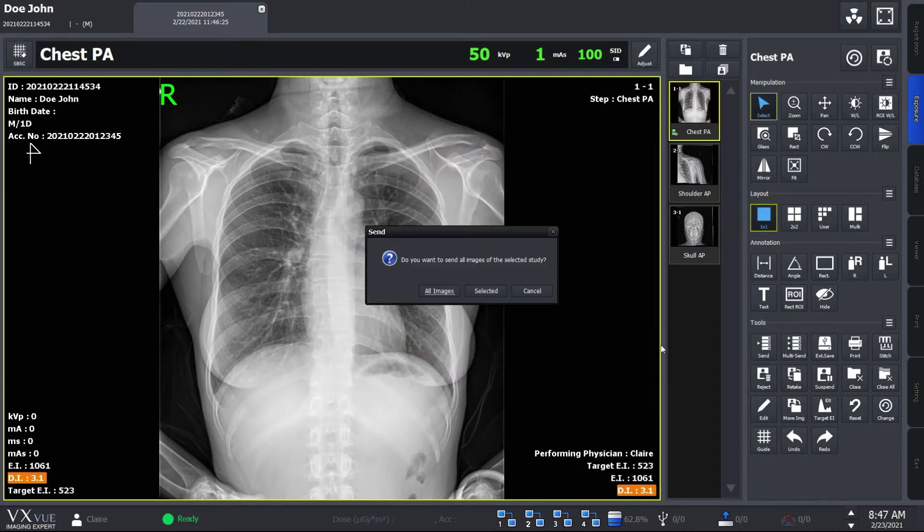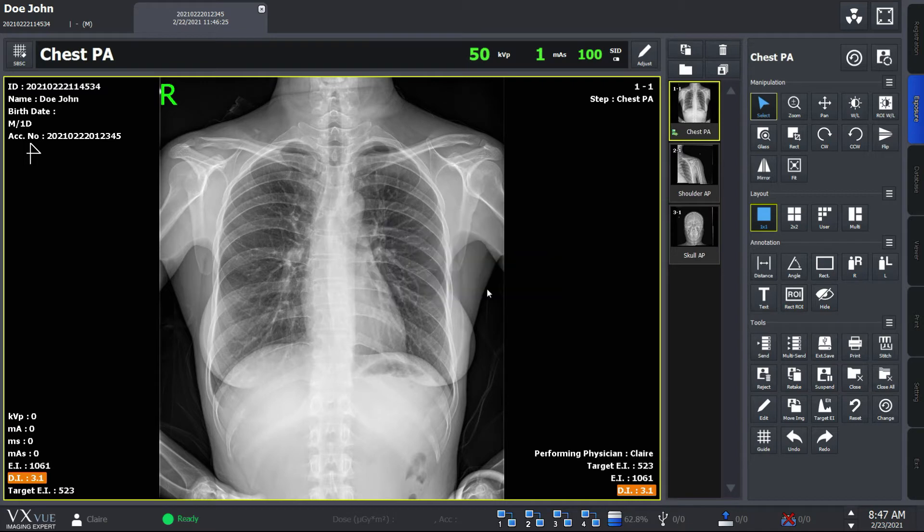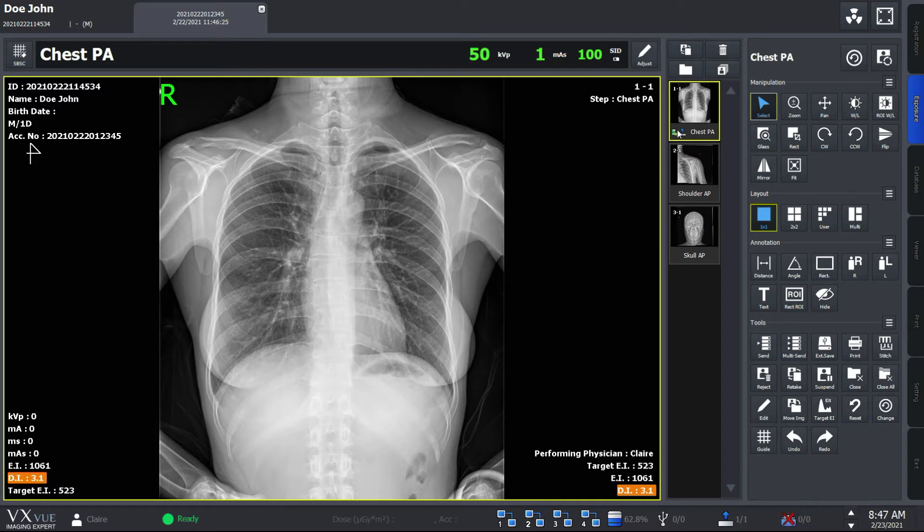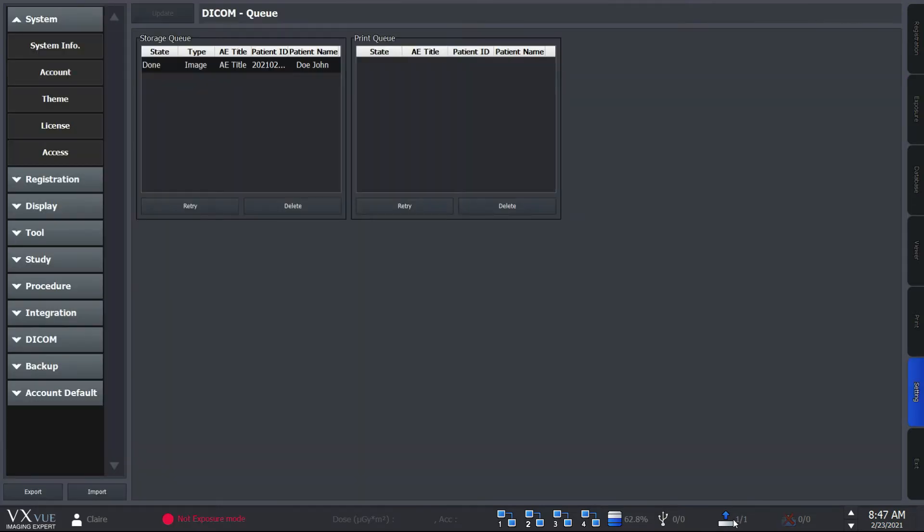The send function allows you to send images to PACS. After sending the images, you would want to check the sending status, and you can do this by checking the thumbnail or checking the status bar down here. Clicking this icon brings you to the Q tab where you can see the detailed status.